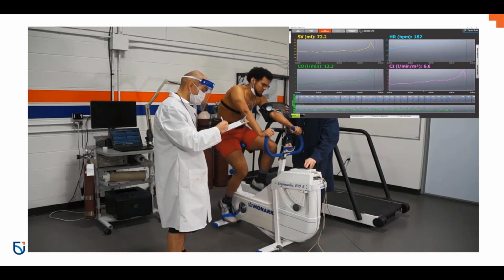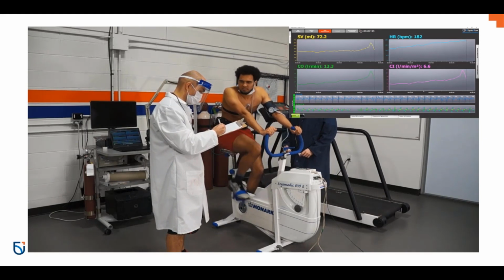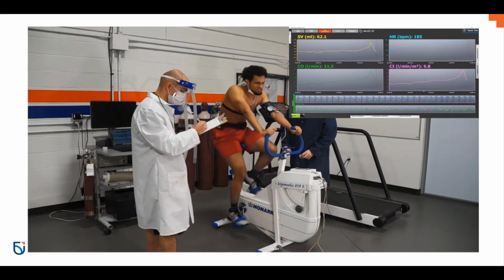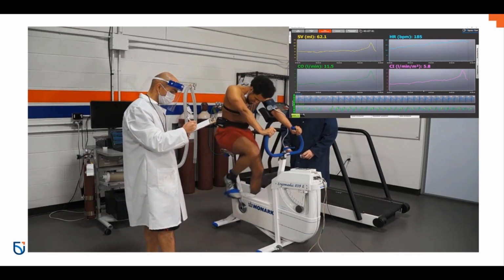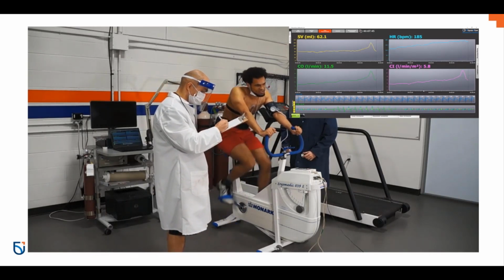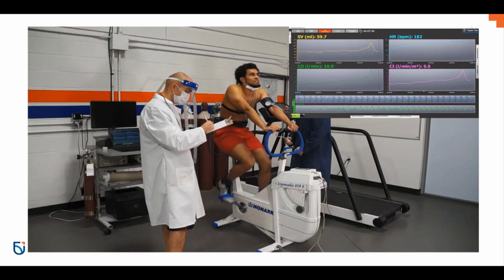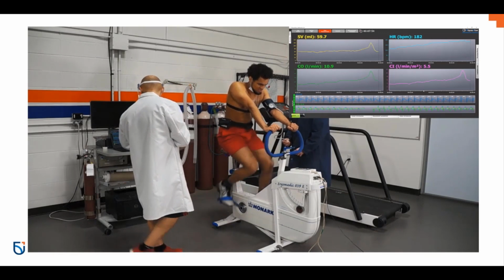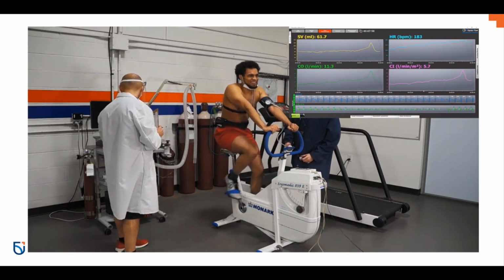That's typical for a VO2 test, but I wanted to get a little bit longer response in terms of looking at what stroke volume could do to cardiac output. It didn't necessarily work out for me at this test, and I said, you know what, let's just leave it in, because that really goes to show you that it does take time and knowing your participant and really knowing exactly how to design that protocol to get exactly what you want out of a test. And even being off by a minute can sort of not give me exactly the demo that I wanted.